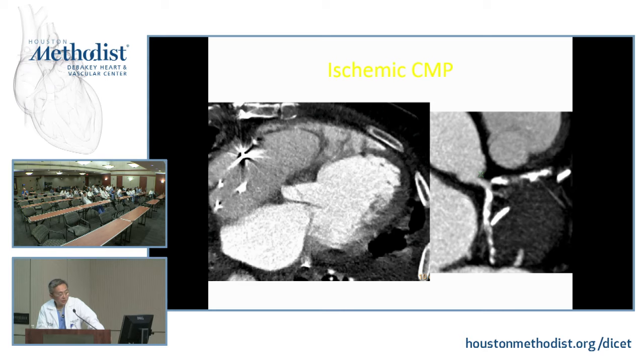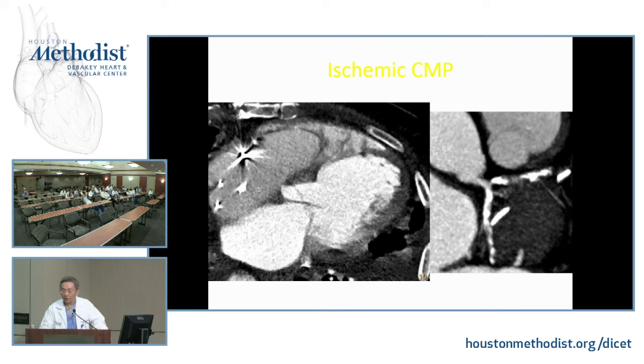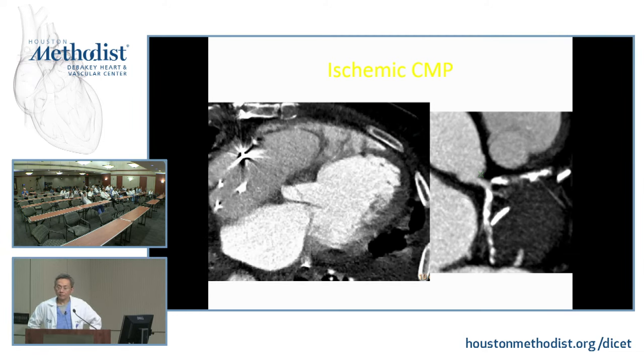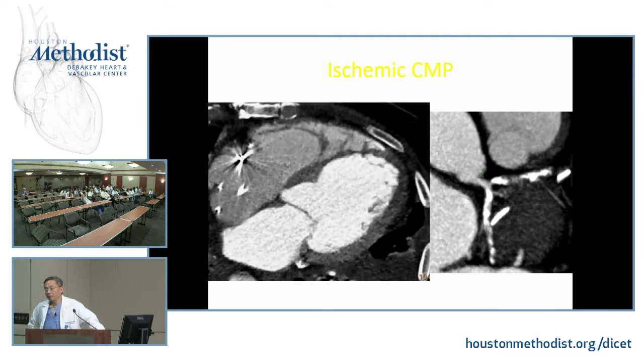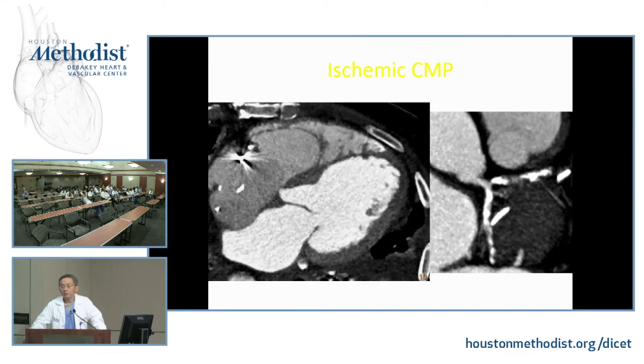Yeah. Can I ask a question? Sure. I think this is a relevant one. I don't know if it's known in the literature, but if I look at this CT angio on the right side, are there any studies that tell me whether either the conglomerate of calcium, as opposed to diffuse, small, mild calcium, either the location or the intensity of it, could conceivably alert the clinician not to push the imager to say something beyond what they can, so that I could stop there and ask for something else instead of doing a CTA?